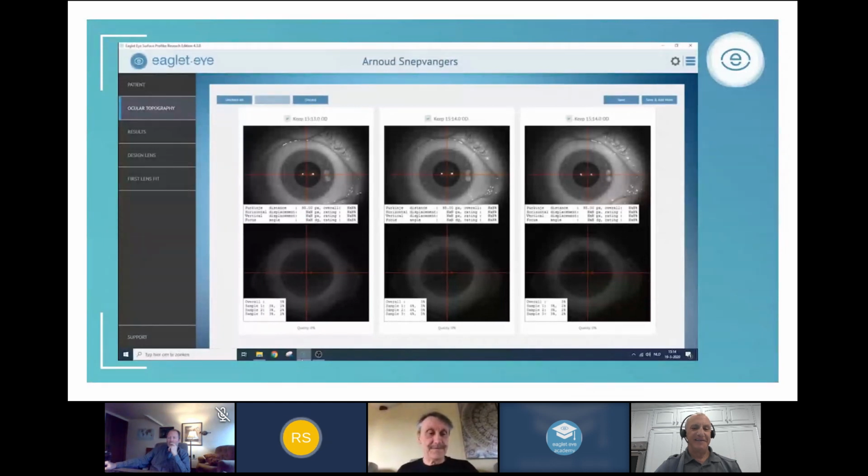Emmanuel Mocchiardini asks, is it better to use a viscous solution with fluorescein? Yeah, that's what we recommend. We recommend a solution containing hyaluronic acid.